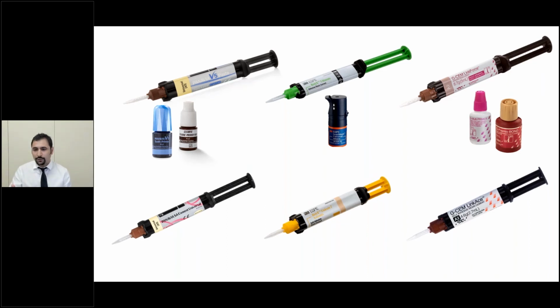You can simply grab one of these, inject it in the intaglio without the need to etch the tooth, and just put it in. So they're very simple to use, much more clinician friendly. You're going to lose a bit of bond strength when you use them, but it's really not significant. So in terms of applicability, much easier, makes more sense.